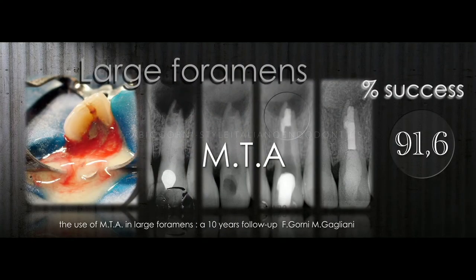The other pathology that has been changed completely with the use of MTA is large foramen. Many years ago, when we treated large foramen, we were in trouble because the packing of that area was really difficult. But today, with the new materials, we changed our approach completely, and we skipped the surgery. Large foramen is treated directly with a non-surgical retreatment. The technique is the same as the one we already described for the perforation.